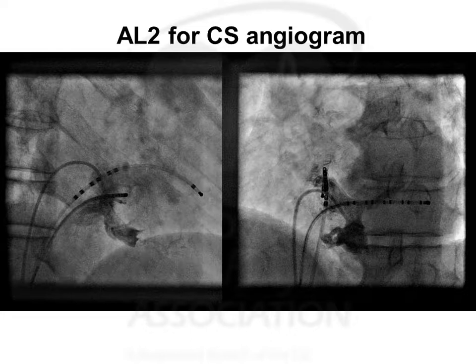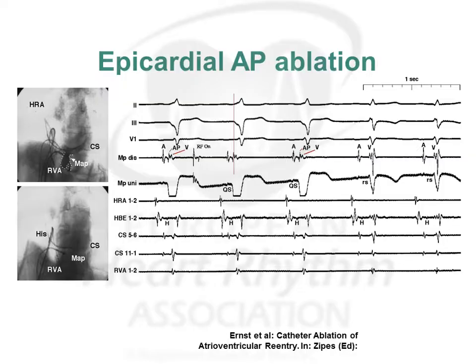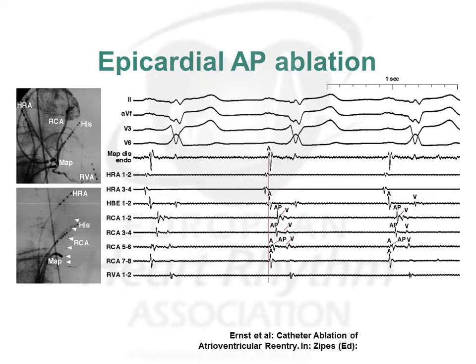And the clue is you need to go to the neck. That's where the accessory pathways are. And again, coming to the neck, you see that here. You can try from below, but if that is difficult, then try it from above, because you get a slightly different angle. And sometimes the angle is enough to get a better position. And then, again, you see the beautiful QS signal that we have had here and the nice AP potential. You turn the RF on, and it blocks nearly instantly. Take all the tricks that you can have, and don't make life difficult. That's really my task to tell you.